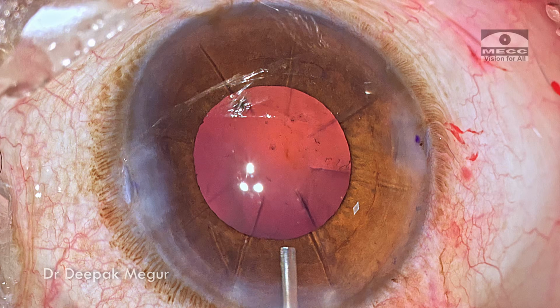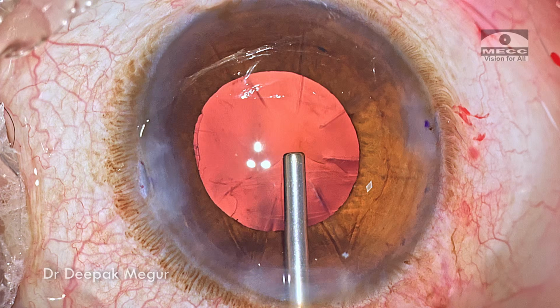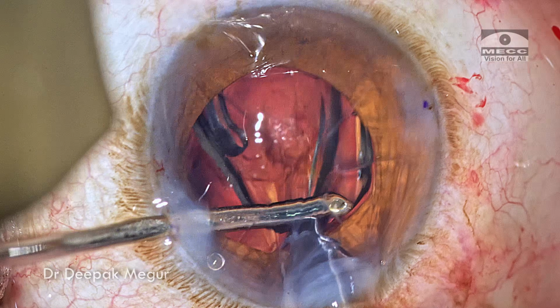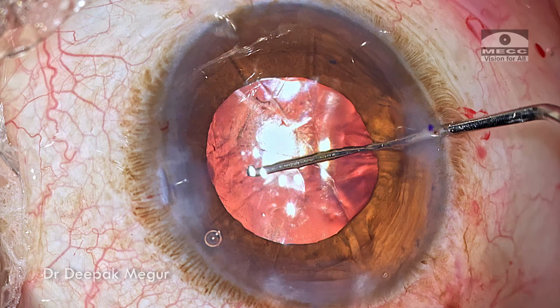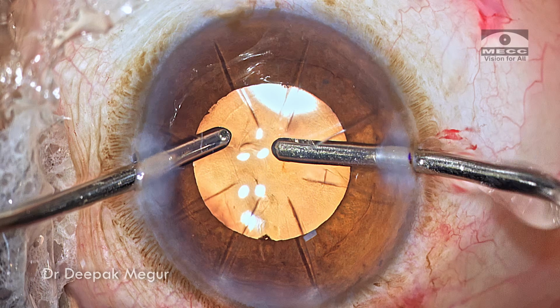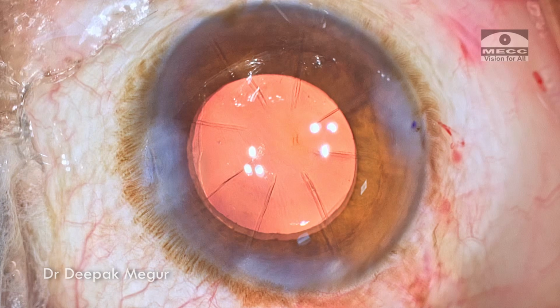The posterior capsule is flushed with BSS just to clean up any of the small remaining fibers. The capsular bag and antechamber are filled with OVD. Time to implant the lens. The planned single-piece hydrophobic lens with appropriate power is being implanted into the bag. OVD both in front and behind the lens is aspirated out. Time to close. The stromal hydration is done gently, as is the main incision.